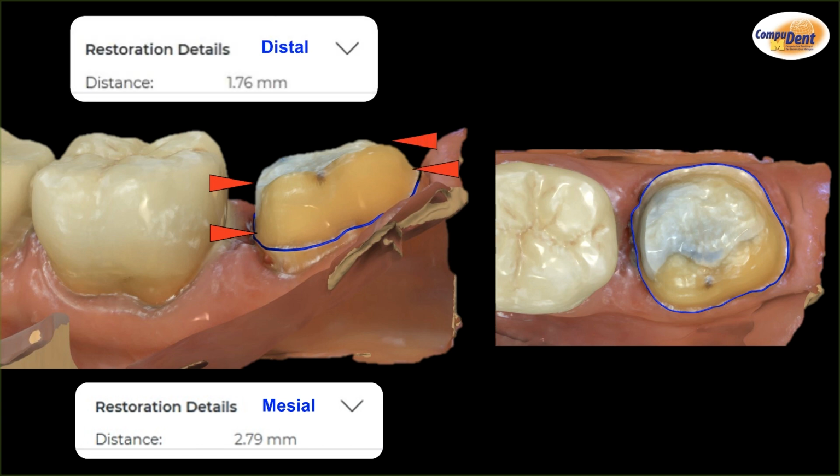And I think this is where people really come into play: if I've got the thickness for glass ceramic there, high strength ceramic, I'm going to bond it because I know I don't have a retentive prep. And keep in mind, retention is based on the shortest wall, not the longest wall. People say, well, I got 2.7. No. Your prep is 1.75. That's not close to what you need for good geometric retention.